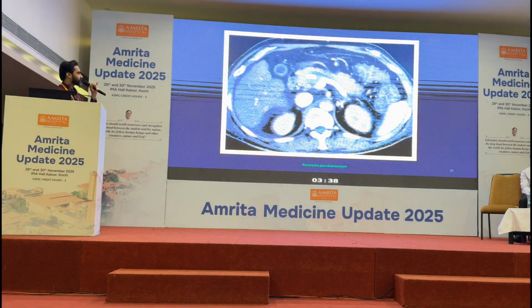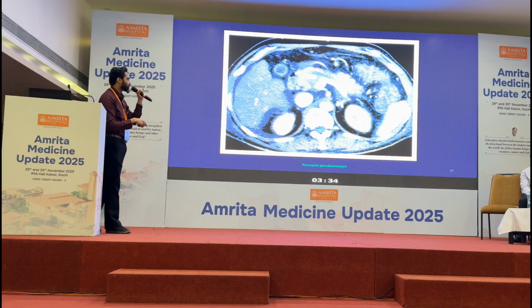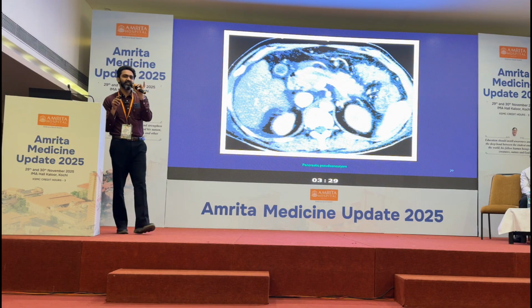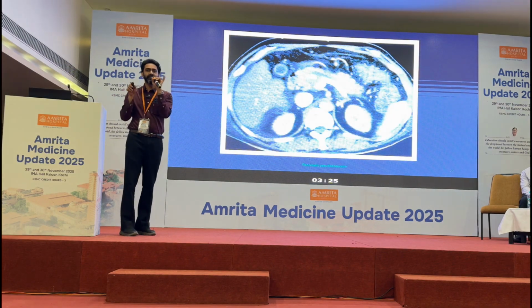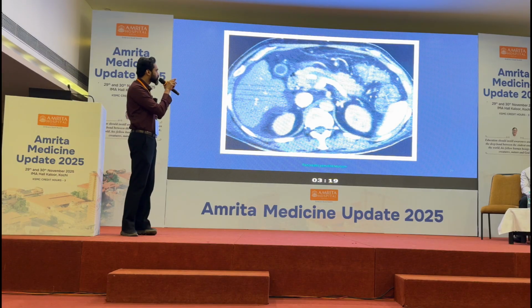This is yet another similar case. Here also the patient had pancreatitis and there was a pseudoaneurysm. But to embolize that, we were not really seeing a vessel which was reaching up to that aneurysm. So only if we can see a vessel reaching to the sac, can we go into the sac and embolize it. Here, there was no vessel, but the pseudoaneurysm was there.